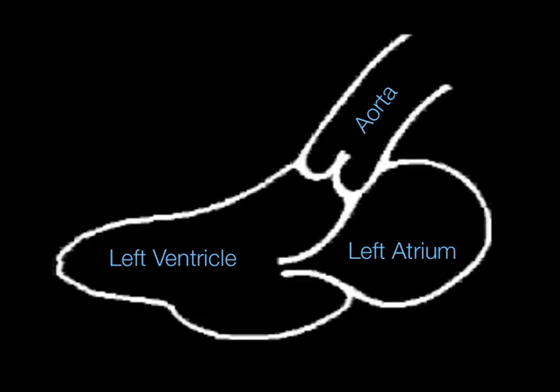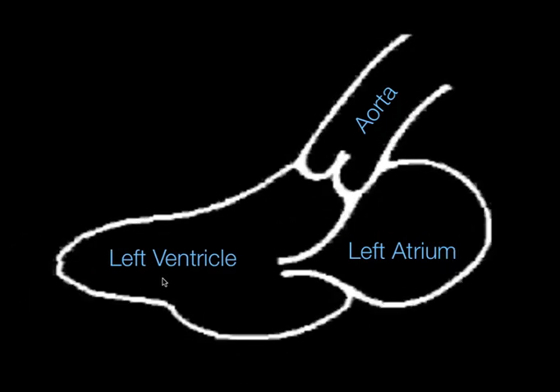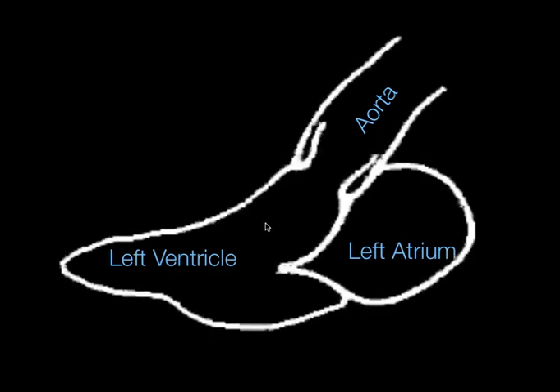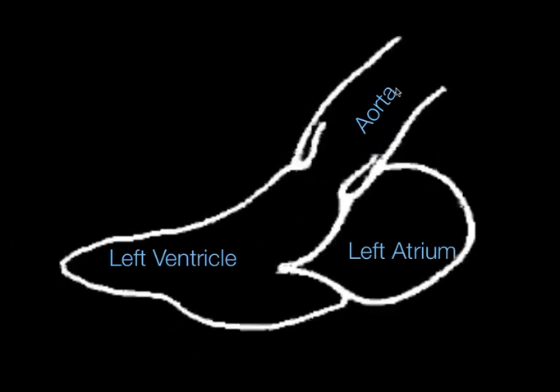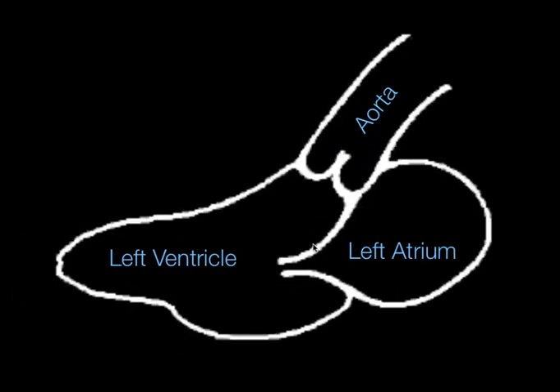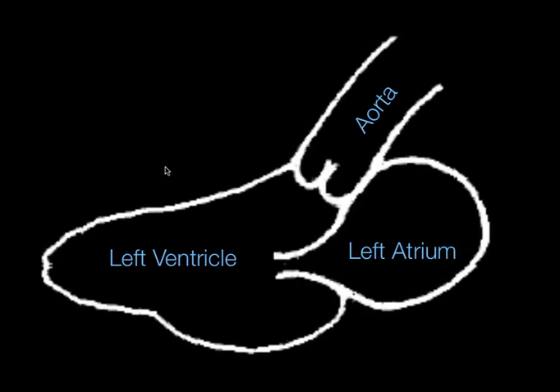And this is not an ultrasound. This is just a schematic diagram demonstrating systole and diastole. So when the heart squeezes, that's systole, it squeezes its contents out of the aorta, and out through the aorta, I should say. And during diastole is when it fills. You can see that during diastole, the valves open and the heart fills with blood. And this is the septum seen here. And the right ventricle, not pictured, would be right up here, parasternal long axis.